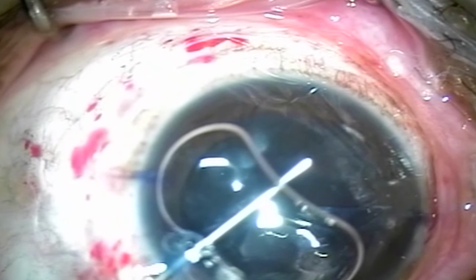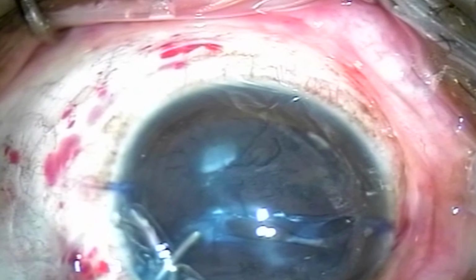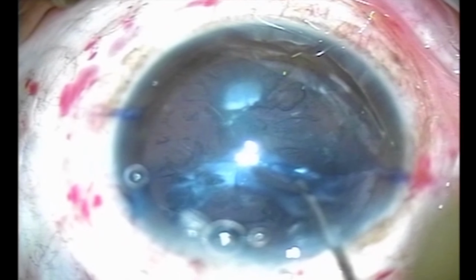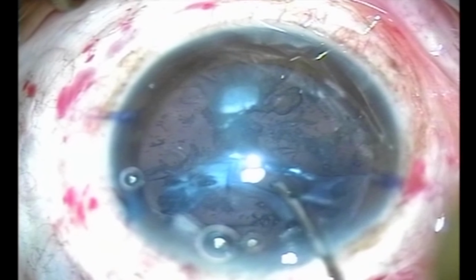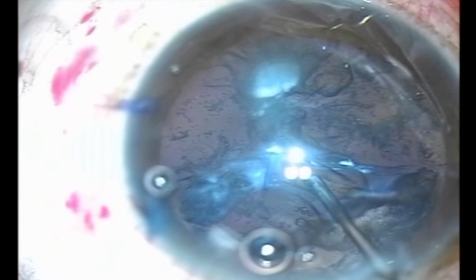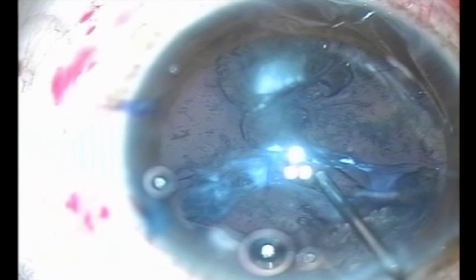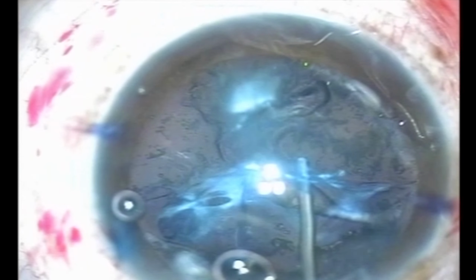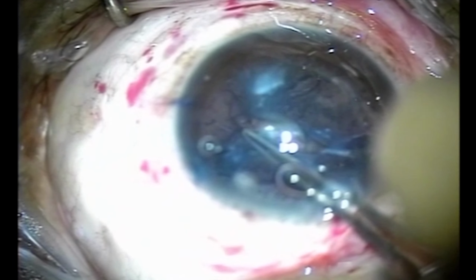I exchange the air bubble now with the viscoelastic. Now I go in with a cystitome, trying to find my edge for making an anterior capsular access. Here I am gingerly and carefully looking, and I even used viscoelastic to separate the leaflets of anterior and posterior capsule in any potential area I could. Not many, as you can see.